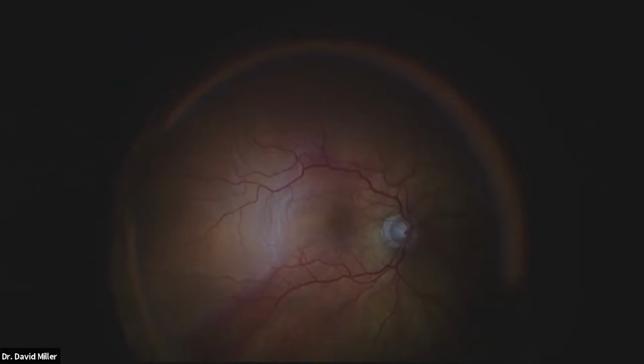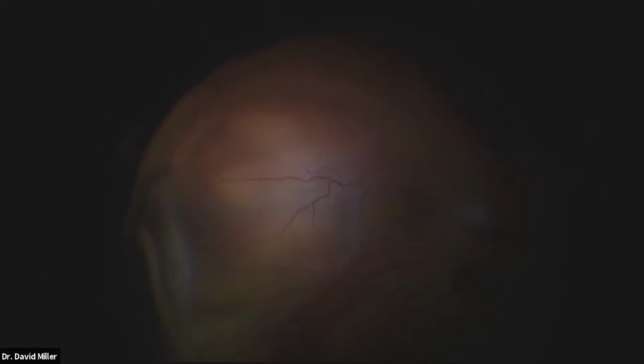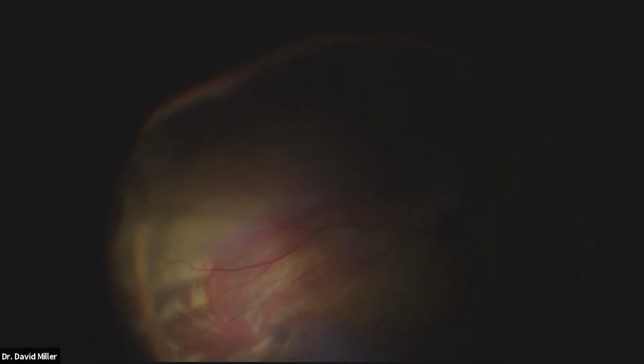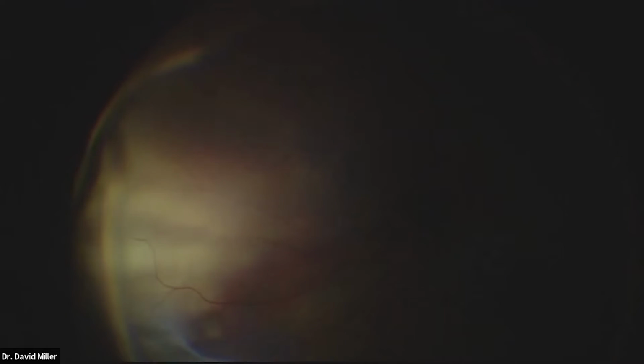So you have a scleral depressor there, Mike? So I'll tend to scleral depress myself when I've got the free hand like this. And we'll take a look here. Mike is an expert at helping me out, doing this over a decade, and the entire room is really quite expert. We do many, many cases together. Again, it's a nice team approach. And we depress under a high zoom, looking for the retinal tears.